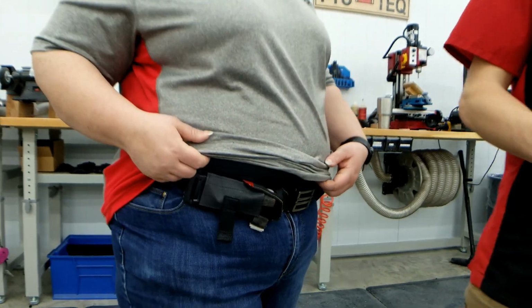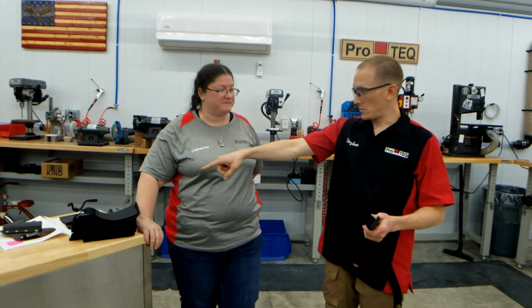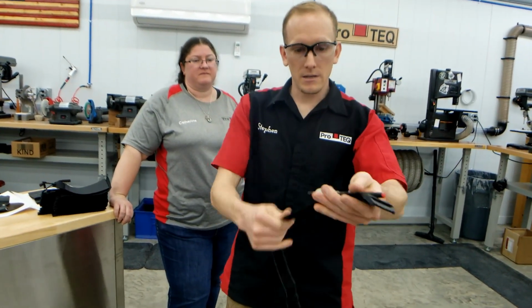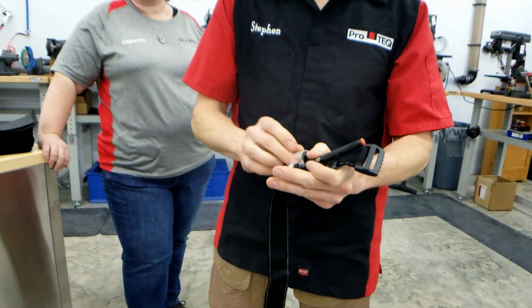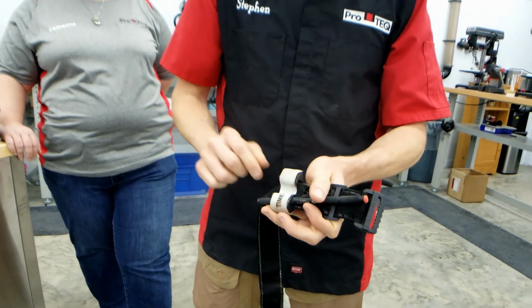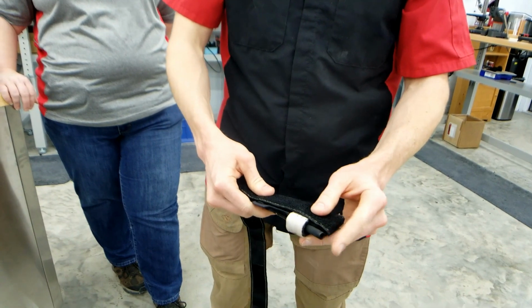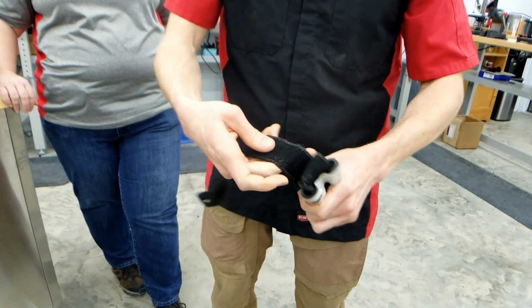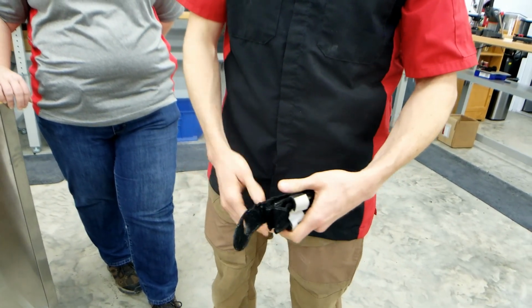Now I'm going to show you how to prep it. And then I'm going to show you my prototype, which I've been wearing since you made it. Is it the original prototype from several months ago? Or no, it's one of these, isn't it? It's the first one of these. So I like to just take it, dress it, put the windlass inside of this little annoying pull tab that gets in the way a lot of the times. So I'll adjust the Velcro to where it's not super engaged and tuck it down in there so it's a little easier to pull off. Then I'll go to the end of the windlass and fold it back and forth from the end of the windlass to the buckle, like that. And then it's ready to go in the tourniquet holder.